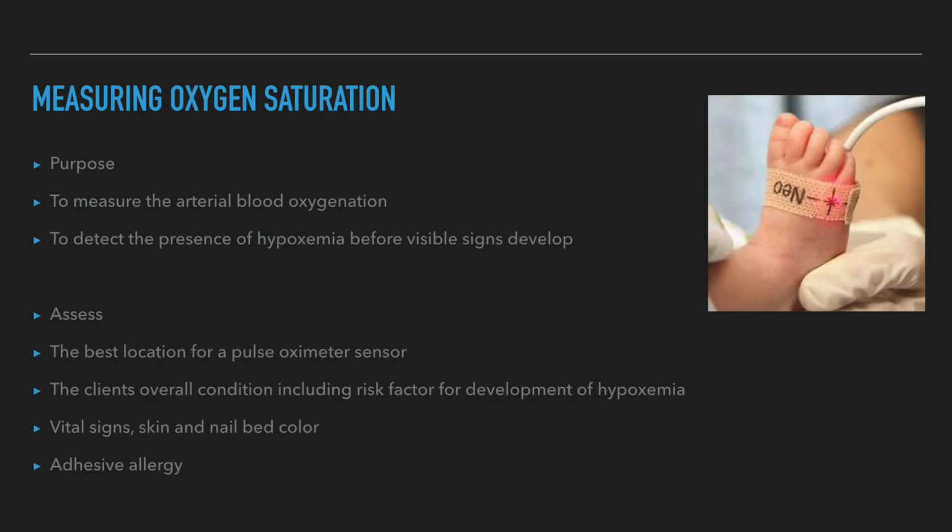Measuring oxygen saturation. Purposes: 1. To measure the arterial blood oxygenation. 2. To detect the presence of hypoxemia before visible signs develop.